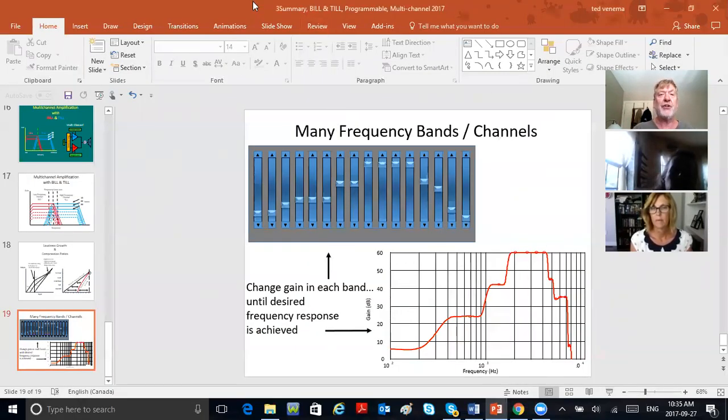Anyway, I will stop sharing. Don't you think the future will be Bluetooth for all these? Don't you think eventually all the companies will go to Bluetooth? I would think so. That gets rid of the cords and cables, and people can use them with their iPhones. Well, they do. People are using their hearing aids, pairing the hearing aid with their phone. My neighbor told me he listens to his music through his hearing aids. Yeah, that's very common.